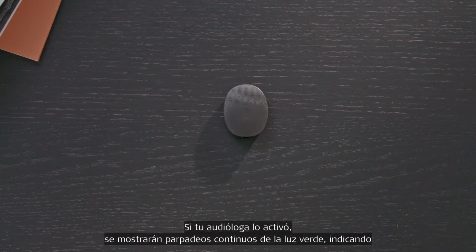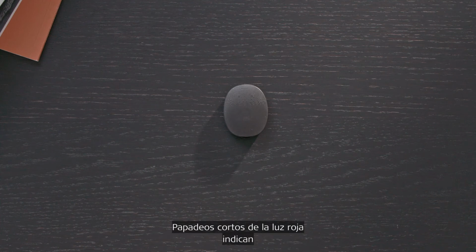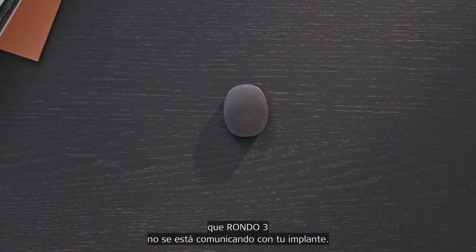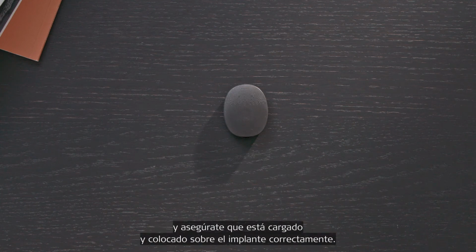If activated by your audiologist, continuous short green blinks will indicate that Rondo 3 is communicating with your implant. Continuous short red blinks indicate that Rondo 3 is not communicating with your implant. Switch your audio processor off and on again, ensure it is charged and positioned over the correct implant.